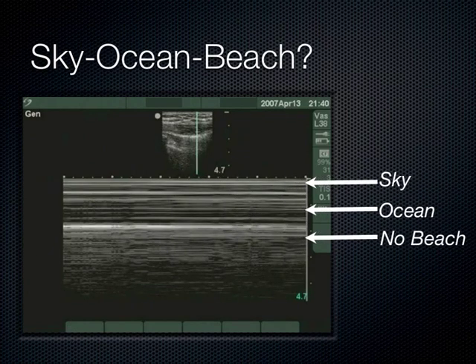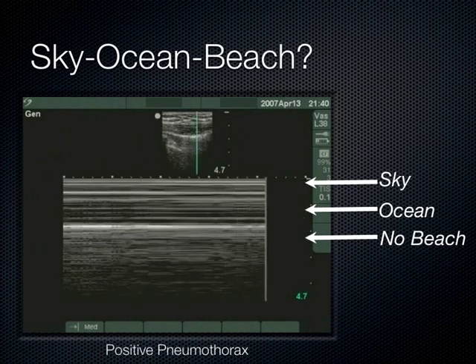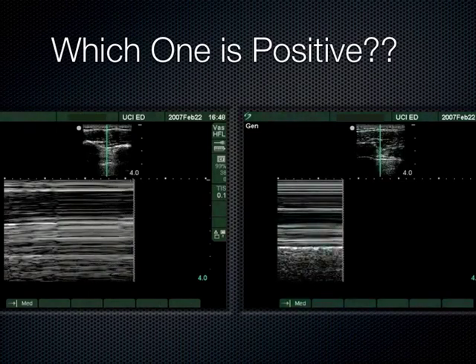Here's another example: a film with multiple A lines, and when you put M-mode through it, it definitely looks like a barcode. The other image shows the beach — the graininess due to lung motion. Once you understand what you're looking for and can find that image, identifying pneumothorax is not a problem.